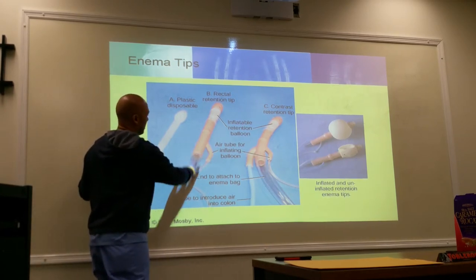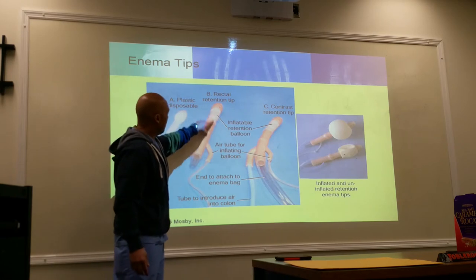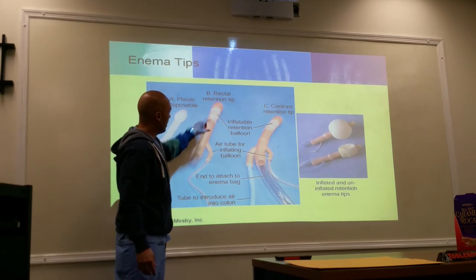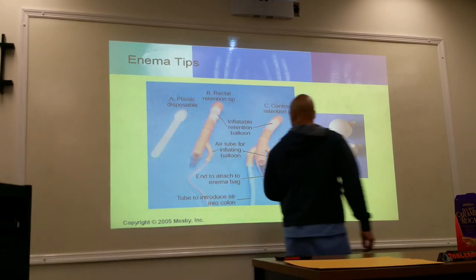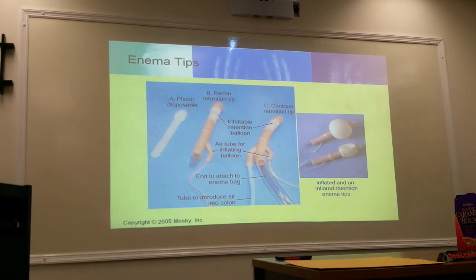We have a rectal retention tip. So at the end, again, the tip is very pliable. At the end, you have the inflatable retention balloon. And then you have this one port, that one line, that you will connect an inflator at the end that will allow you to inflate your enema tip, okay? And then there is a clamp here that will allow you to prevent any air from leaking out so the air doesn't go back into your inflator cuff, okay? And to let the air back in, you just open up the clamp and air goes back into the cuff.